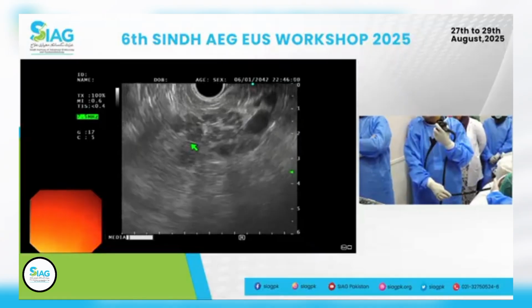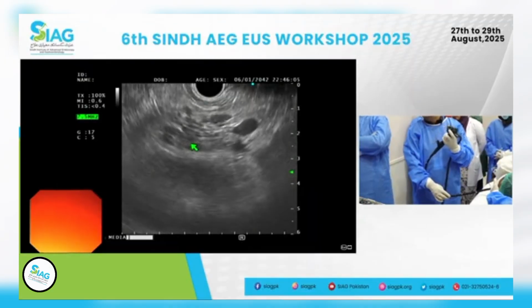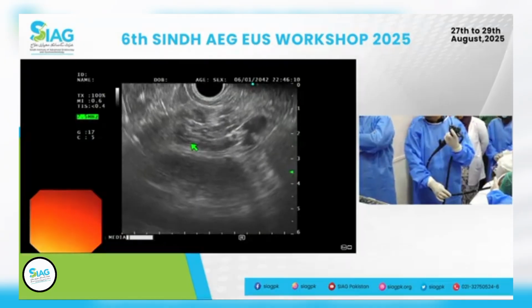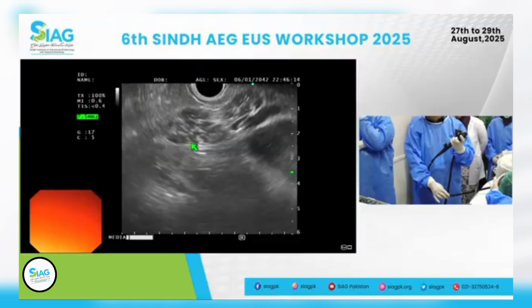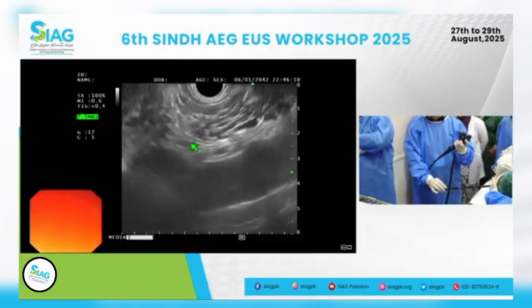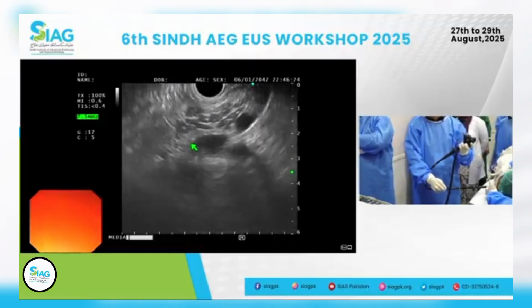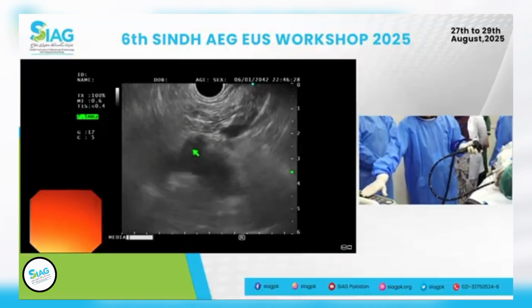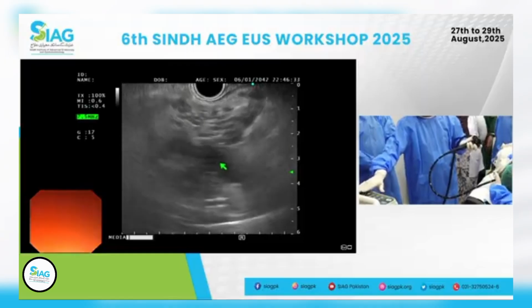the pancreas is trying to go away from me, so I'm going to push the scope in, big wheel towards me, rotating it to the left. You see the left kidney starts coming up. Left torque, the pancreas is still there. Keep going until you see it's going to fall down, and that's where the splenic vein and SMV get together right here, forming the portal vein.